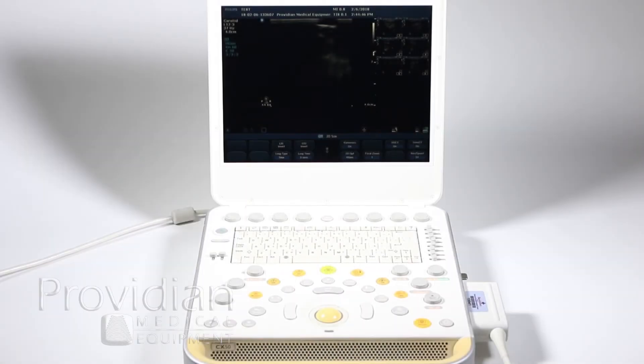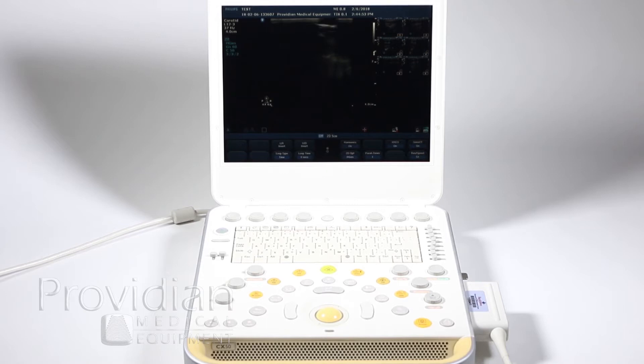For Doppler and M-mode imaging, I'm going to start off with the linear transducer to show Pulse Wave Doppler, and then I'll switch over to the sector transducer and show you how everything's done in cardiac.